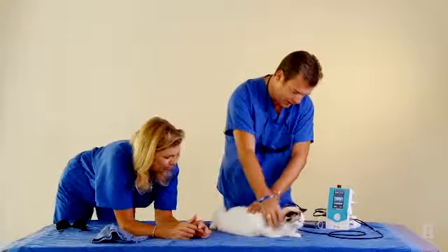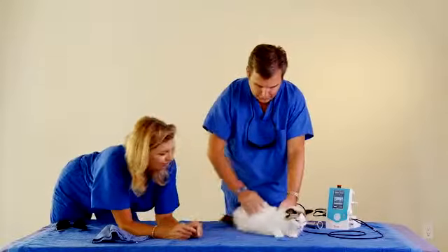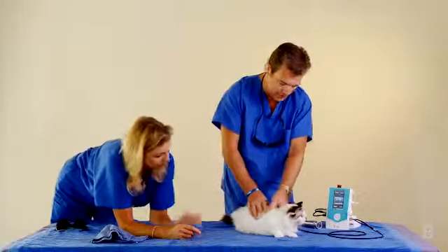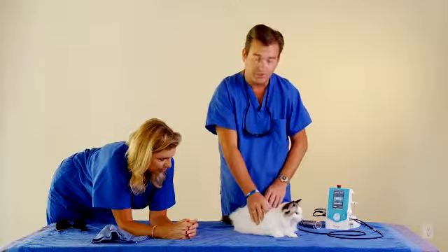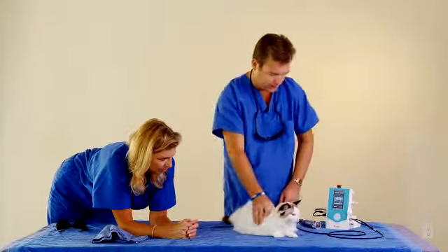So we got the cat just a little nervous here. We're going to do a stifle, arthritic stifle, and again, we're just turning the targeting beam on the laser. We're not actually treating a healthy animal here. So for training purposes, you won't hear the beep, and we're just going to have the targeting beam. But you can kind of see the techniques and how the animal is going to react.